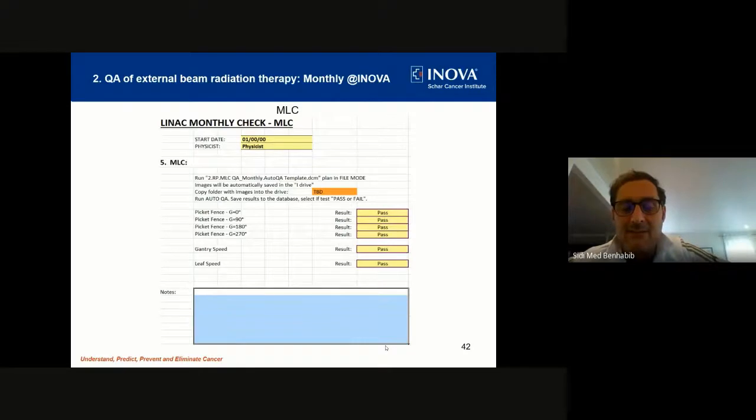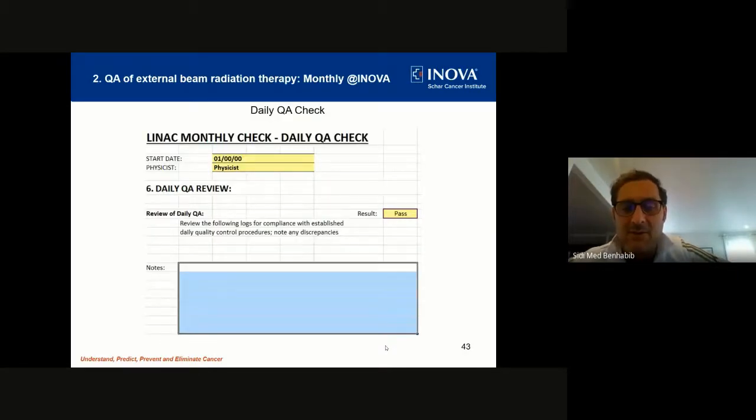Next slide. I apologize, I'm going quickly through the slides because I already spent 55 minutes. We also have to check the daily QA that was done by therapists. So we check all the data for output, flatness and symmetry for a month. This is part of our monthly QA. Next slide.